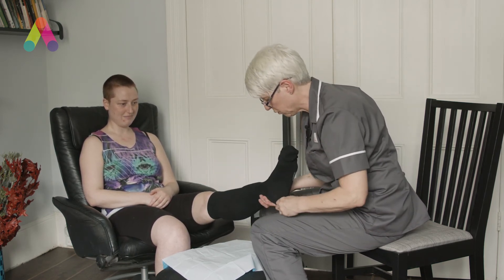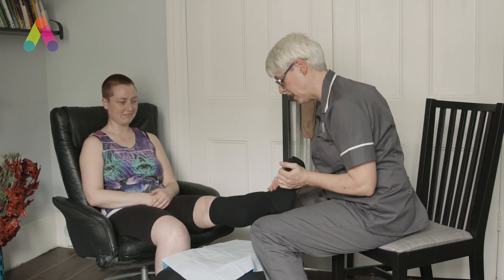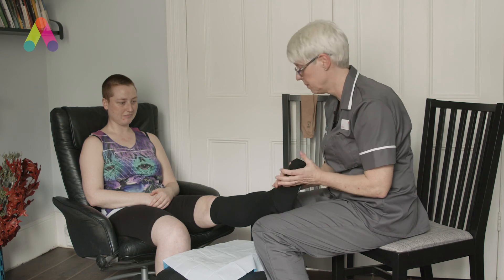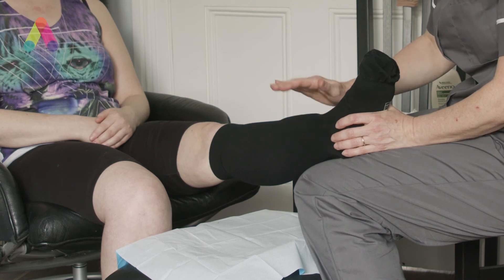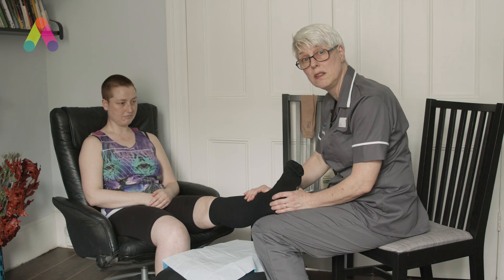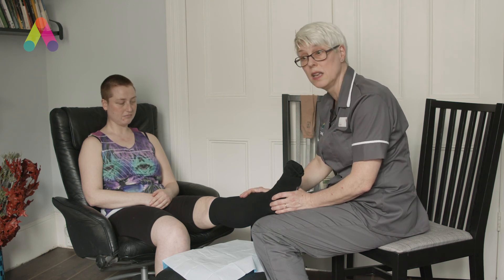Faith actually has quite short feet, so these are quite long in the toes, but at least they won't be digging in at the toes. This is light compression — we can use it now when you haven't done an ABPI, and this is safe to use for a few weeks. If the wound is progressing and healing then that's excellent; if not, then we need to have a full lower limb assessment in the next couple of weeks.